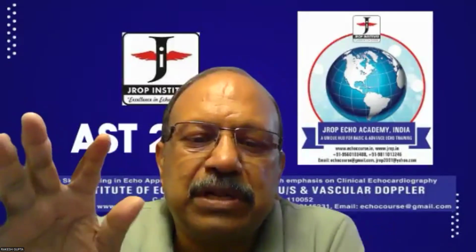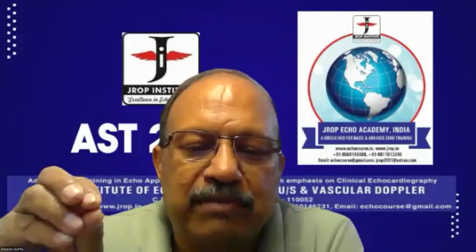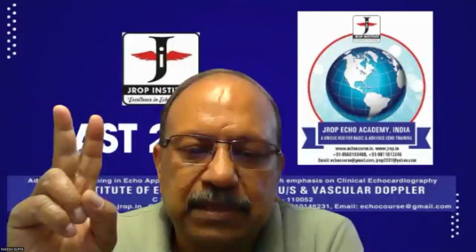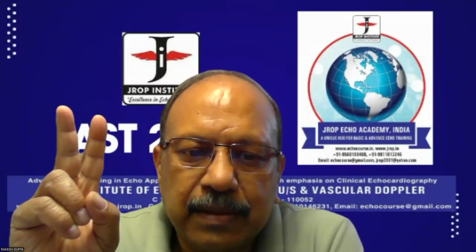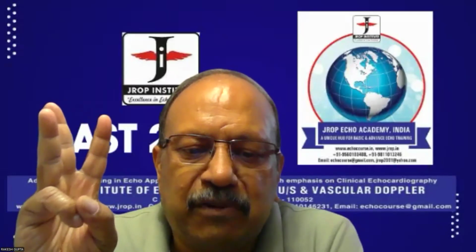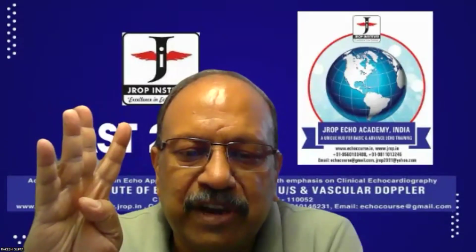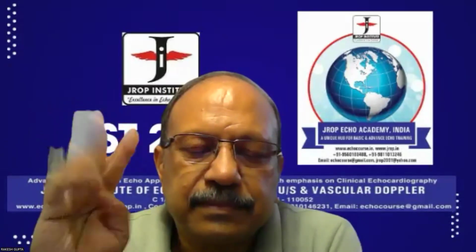Okay. So for aortic valve area we see the gradient and the dimensions. I made you remember important things. First: stroke volume, LVOT VTI divided by aortic valve VTI, will give you aortic valve area by the continuity equation. Second important thing is peak velocity more than 4 meters per second by continuous Doppler. That will tell us about severity: more than 4, severe. Third is mean gradient more than 40 millimeters of mercury: severe. Fourth is dimensionless index 0.25 or less: severe. So these 4 things we have to remember.